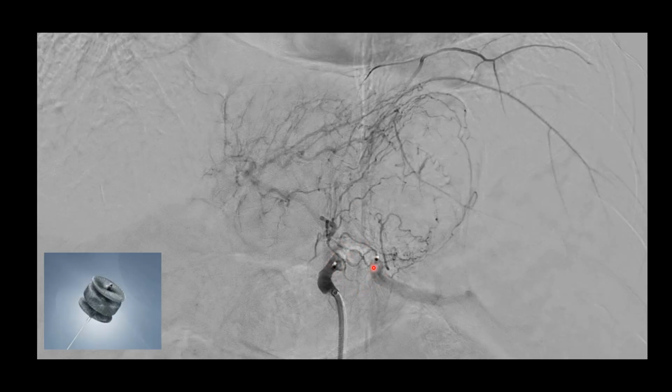We put a plug here proximally, but we still see the short gastric vessels enhancing and some blood flow going over to the spleen. It's not an appreciable amount. It's not enough that they're going to bleed out from this, but hopefully we can preserve some perfusion to the spleen. And this picture is just what the plug would look like outside of the body.